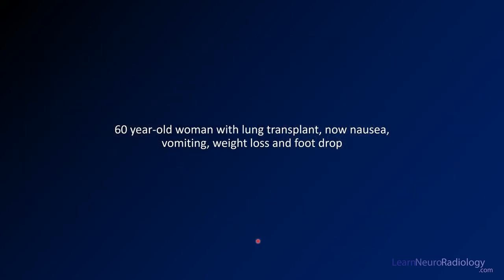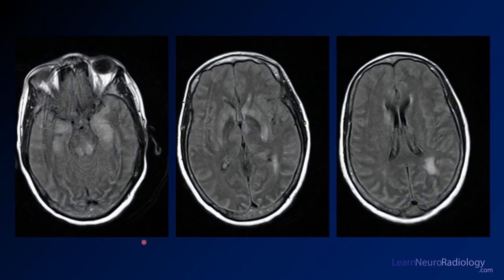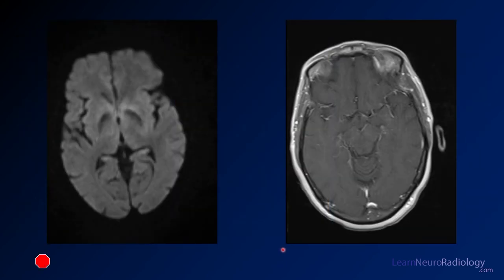Our next case is a 60-year-old woman status post lung transplant who now has nausea, vomiting, weight loss, and foot drop. You see patchy white matter abnormalities on FLAIR — the hippocampi are not normal, the dorsal midbrain is not normal, with patchy periventricular white matter abnormalities. The fluid suppression on FLAIR doesn't seem complete. Diffusion and post-contrast imaging are pretty normal, with not a lot going on.